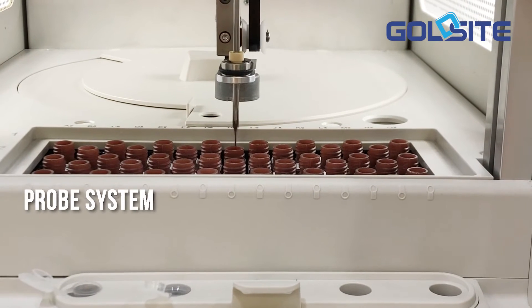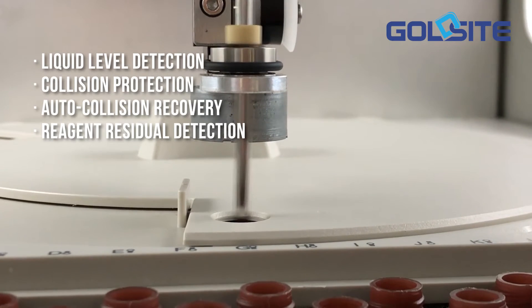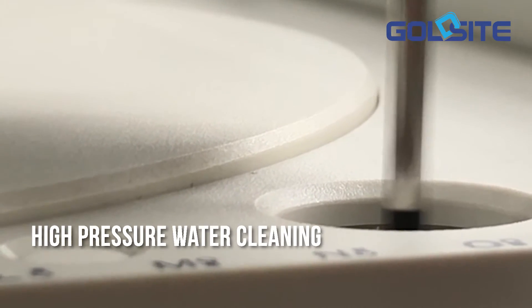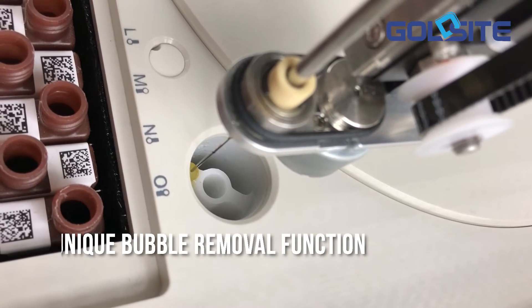The probe system offers liquid level detection, collision protection, and auto-collision recovery, as well as reagent residual detection. The probe is cleaned by high-pressure water, and the unique bubble removal function can improve the accuracy of the test results.